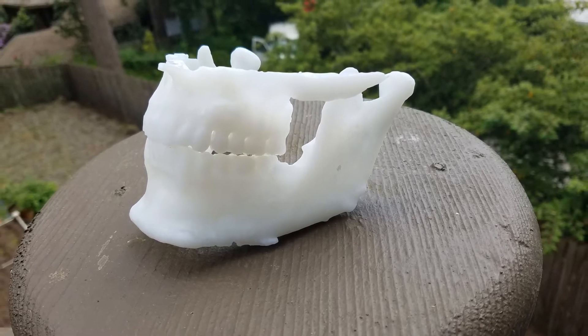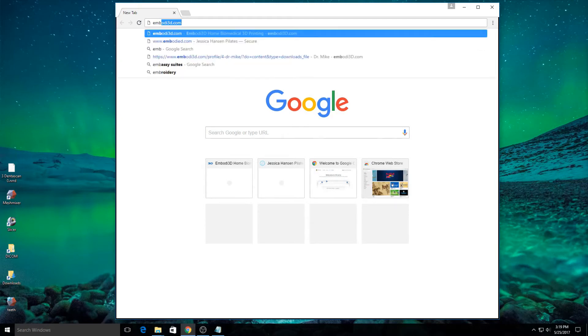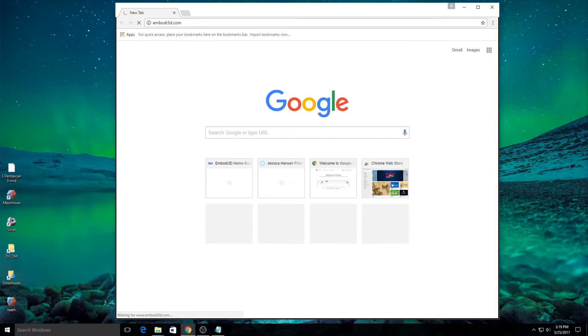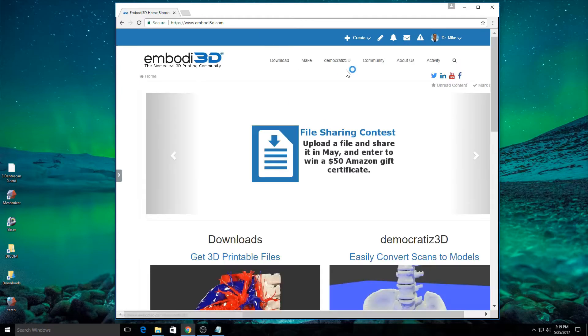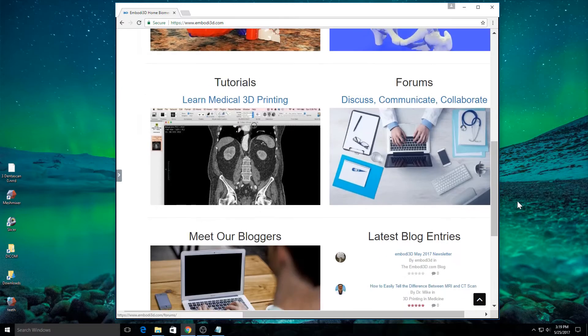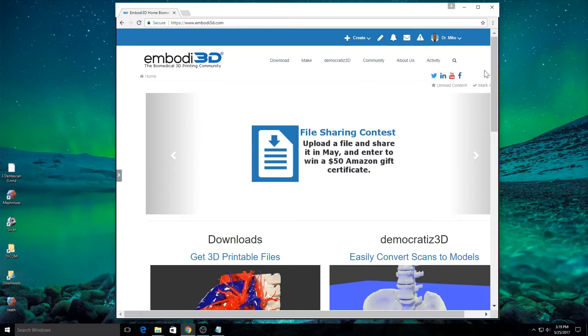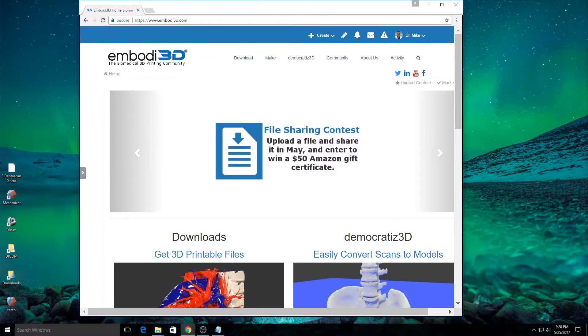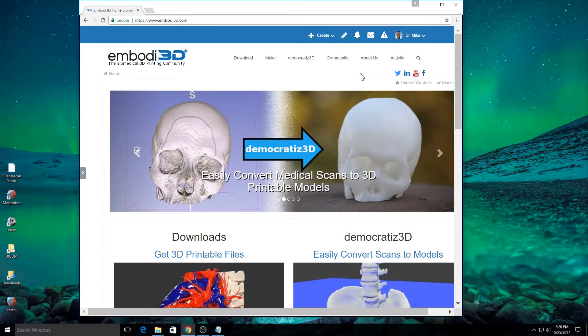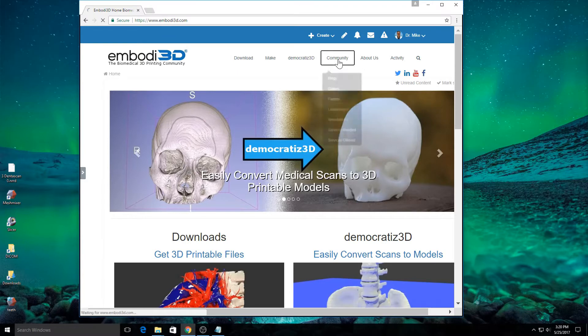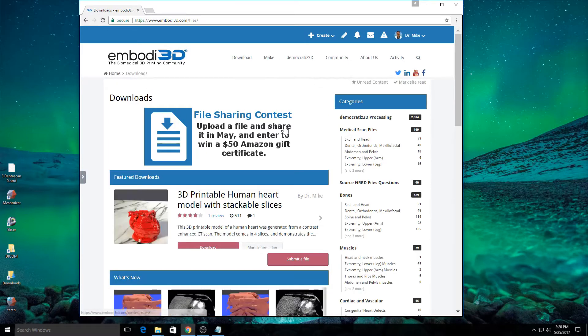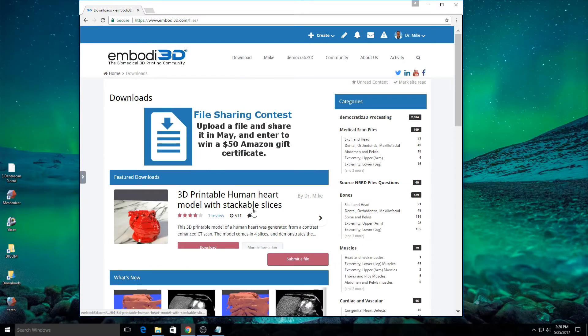Go ahead and open up your web browser and go to Embodi3D.com. That's E-M-B-O-D-I-3-D.com. This is the Embodi3D.com website. It's an online community of medical 3D printing enthusiasts and it has a variety of very interesting resources, most of which are for free. If you click on the download navigation button, this will take you to the area where you have free medical file downloads.